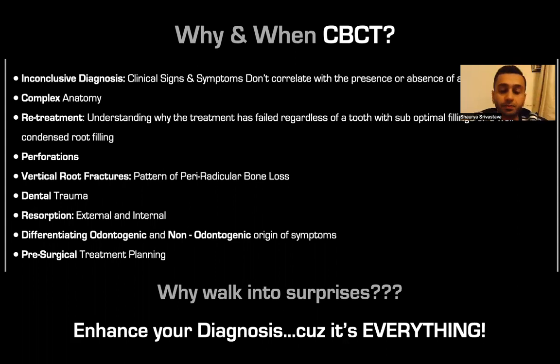Even for primary cases, not that I do too many, I work in referral practice, so I do mainly retreatments. But even if I'm doing a primary, I would still take a CBCT so that I can understand anatomy, understand where my axis may be, measure my working lengths, even though we have apex locators, but it saves me time and makes it more predictable.